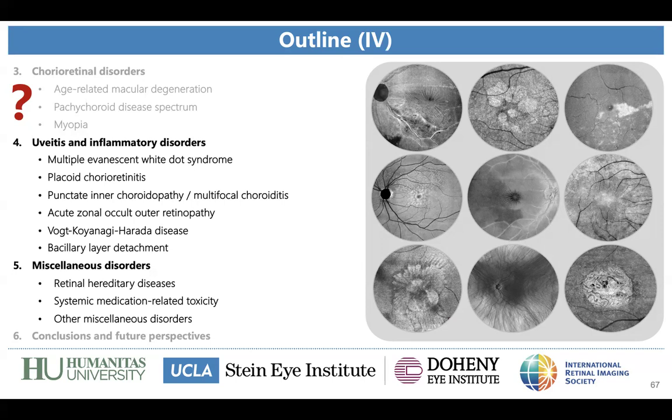There is especially a study by Riccardo Sacconi and co-authors and Giuseppe Querques' group showing that there are some different choroidal patterns. There are, for example, the reticular pattern. There is also the herringbone pattern. In the review, there is a little paragraph about that. And these patterns are actually more and more studied with en face OCT.